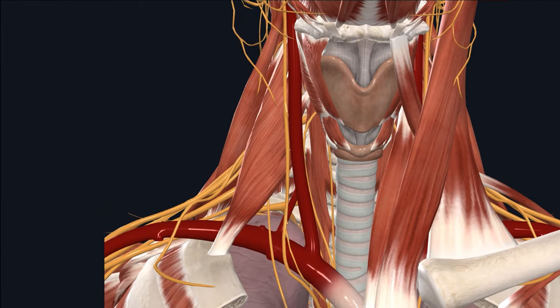Once you go fully through the thyroid gland, you will identify your tracheal rings appearing as white cartilage structures. In some patients with a short neck or cervical fusion, you may have to use a cricoid hook to lift the cricoid and trachea superiorly for better exposure. From the inferior margin of the cricoid, identify your second and third tracheal rings, which is where the tracheal opening is commonly created. Avoid using the first tracheal ring for the opening, as it will likely lead to problematic subglottic stenosis.